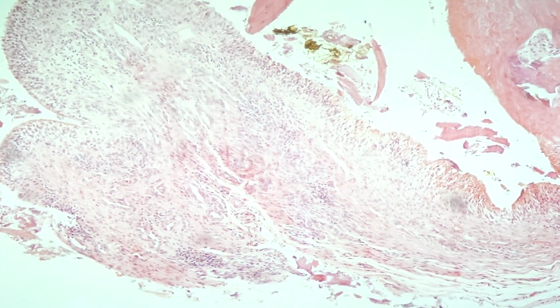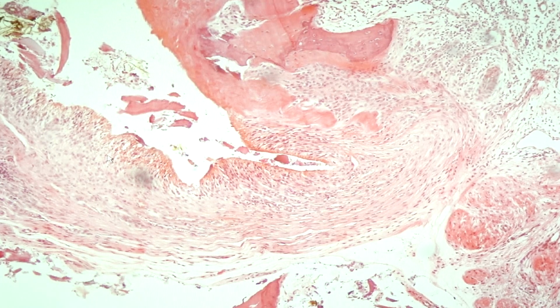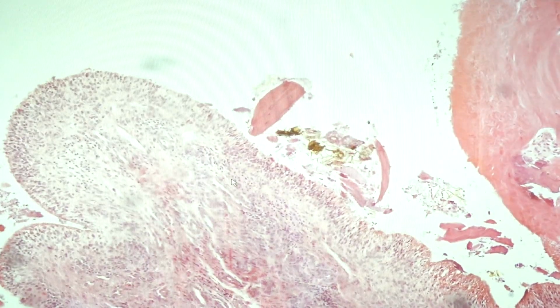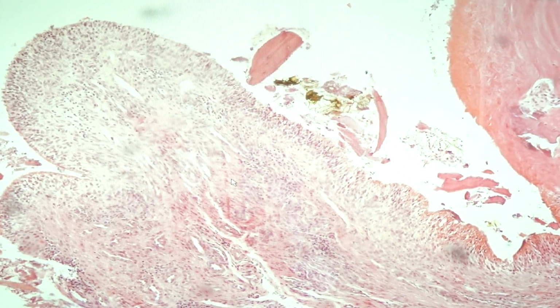In this portion, you have something like a polypoid tissue. This polypoid tissue would arise from the surface. So this is what we call the pannus, PANNUS. It's a synovial overgrowth.